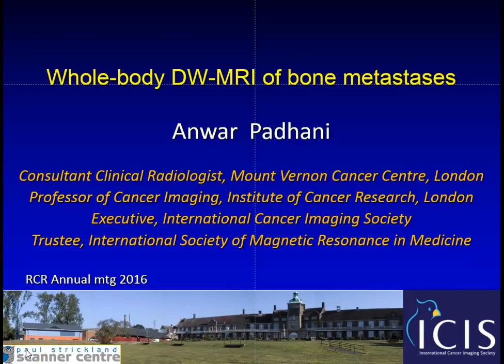Hello everybody, this is a quick run through on the use of diffusion imaging for the assessment of bone metastases as part of whole body examinations.